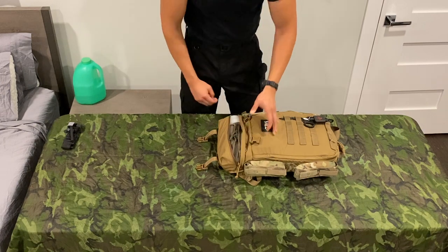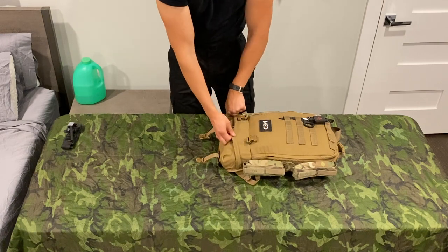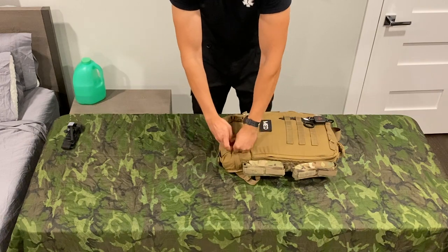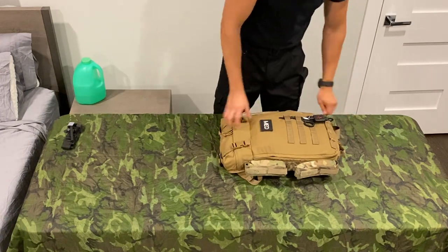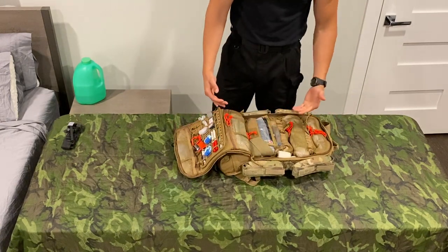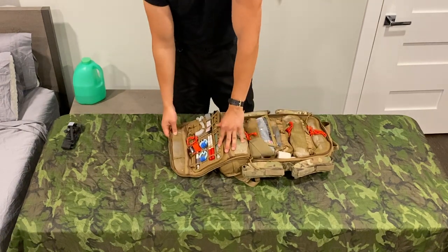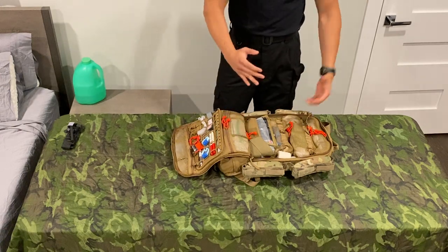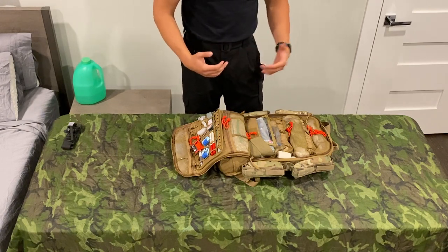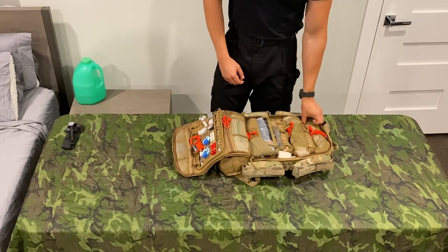Also in there is a SAM splint, which is one of the things you're probably more likely to use than anything else when you're using these for training in the mountains — which is what I use it for. A broken arm or leg is probably one of your more likely injuries that you'll have to treat. The whole bag clamshells open and makes it super easily accessible where you're not having to dig through it, and that is probably one of my favorite things about the design of this bag, as well as the low profile. It's not really big like the Blackhawk Stomp or even the North American Rescue Aid 4 bag. This definitely makes you strip down to what you really need.